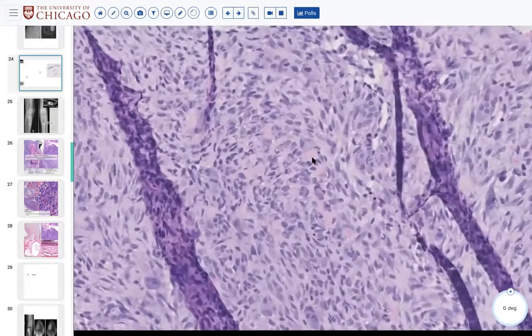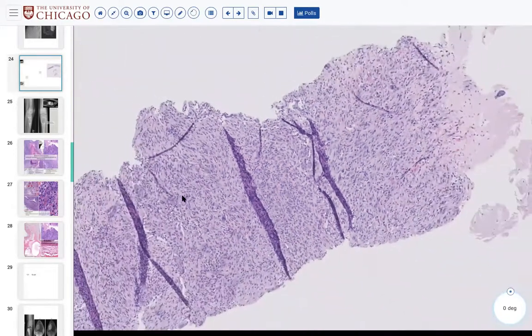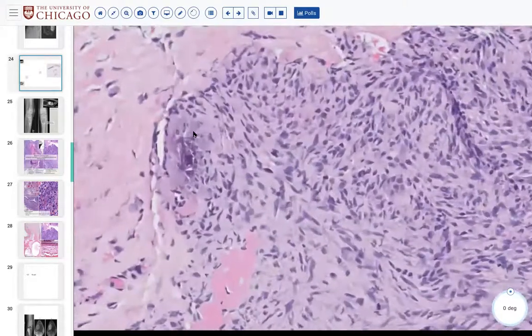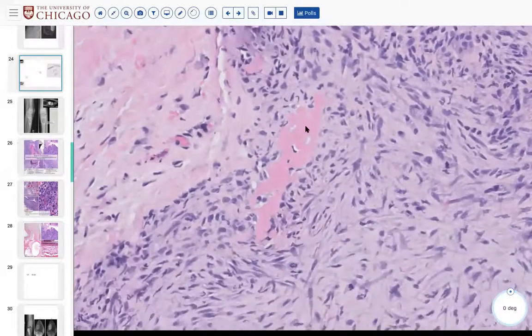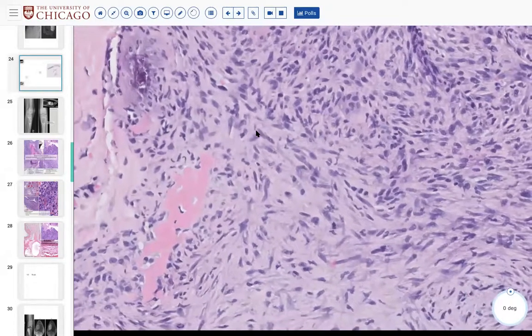curvilinear fascicles. We do see some pale pink osteoid in the back here. That's totally fine for this lesion. The other thing that we see in the background is right here. So very occasionally and very rarely, you might get this so-called blue bone. So in aneurysmal bone cyst, sometimes you get just characteristic eosinophilic osteoid, but be mindful that the cells within it are not atypical. They're small, they're crushed almost by the osteoid, as opposed to being malignant appearing. And sometimes the bone in ABC is blue, as here, almost kind of purplish blue calcified. So that's another soft sign.